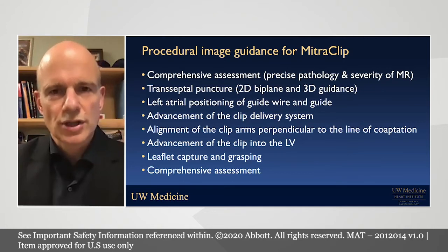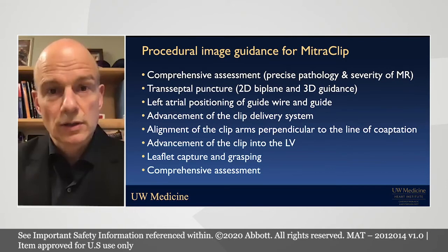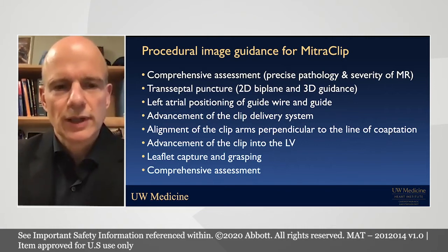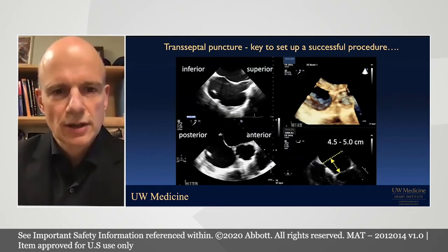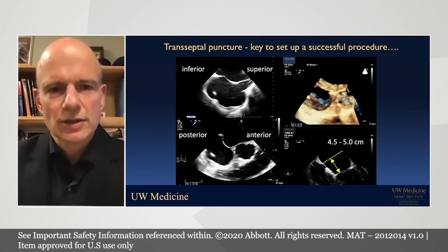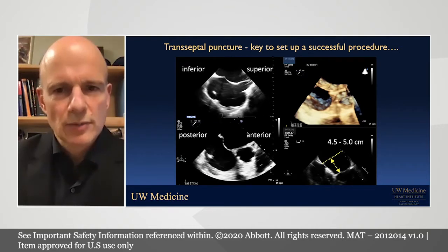And then the orientation of perpendicularity in concert with a clear understanding of the pathology that we're treating, and then certainly leaflet capture and grasping, as well as the comprehensive assessment at the end of each grasp and each delivered clip.